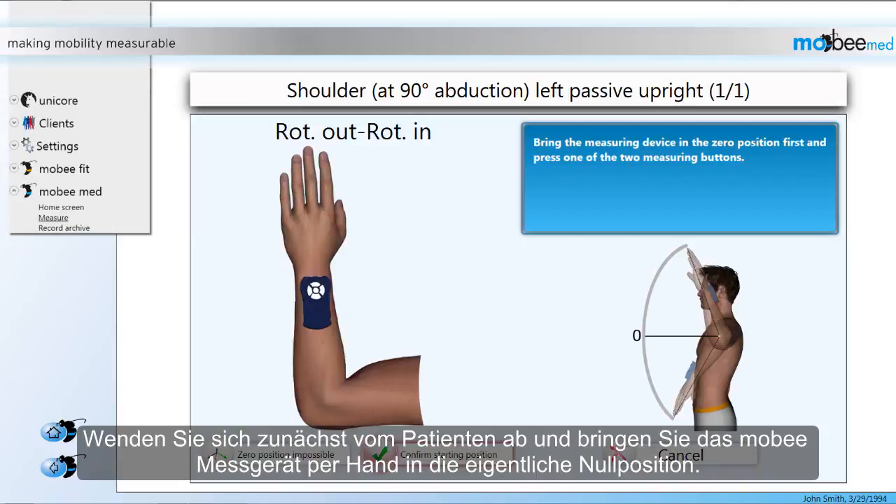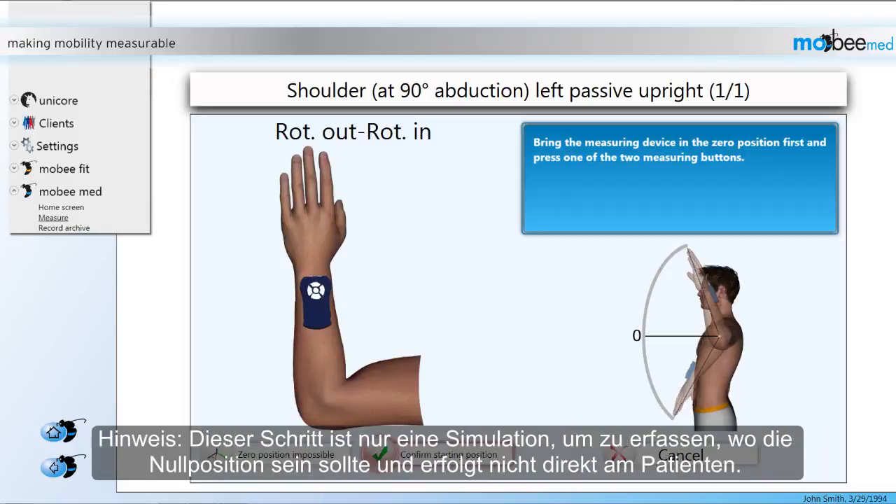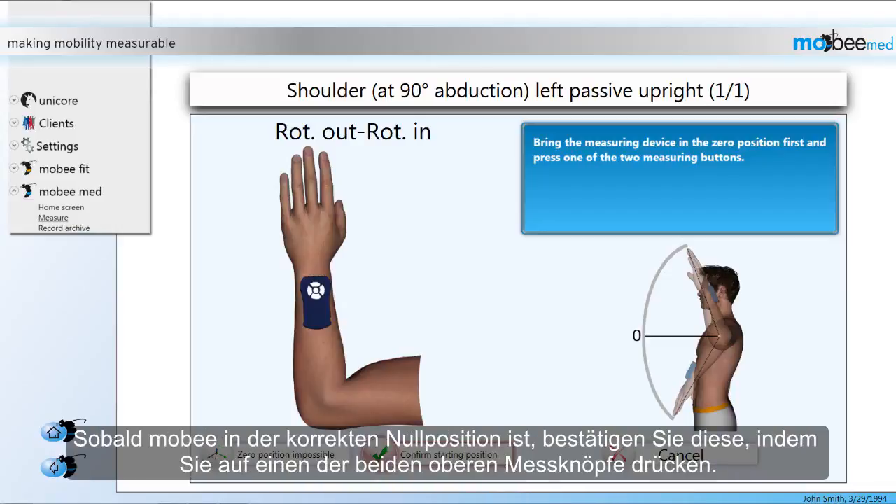First, step away from the patient and simply hold the Mobi device in the actual zero position. Please note that this step is just a simulation of where the zero position should be and does not happen directly on the patient. As soon as Mobi is in the correct zero position, confirm by pressing one of the measuring buttons on top of the device.